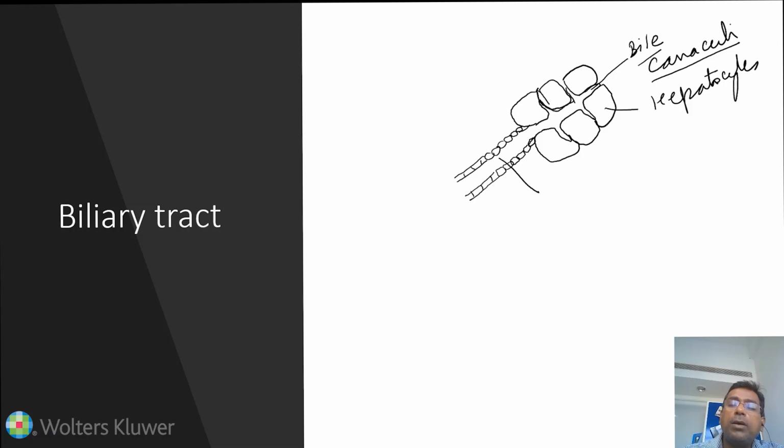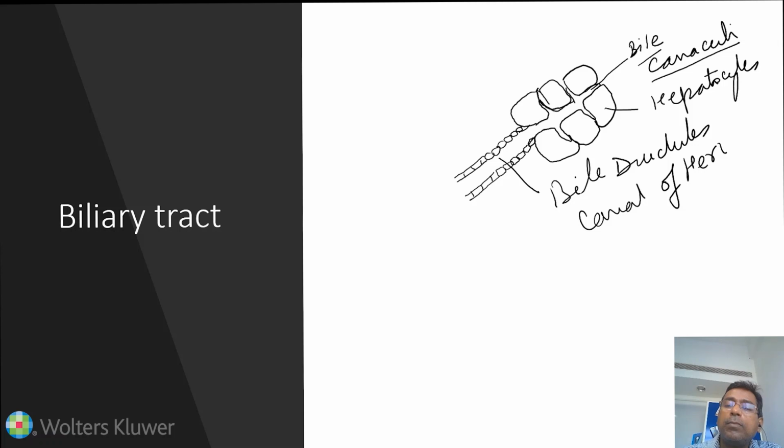These are bile ductules, or they are also known as canal of Hering.